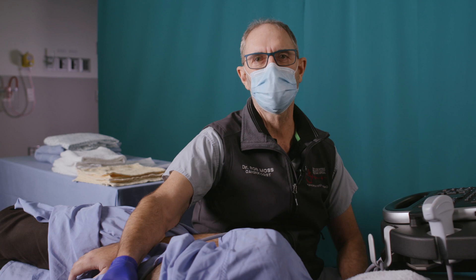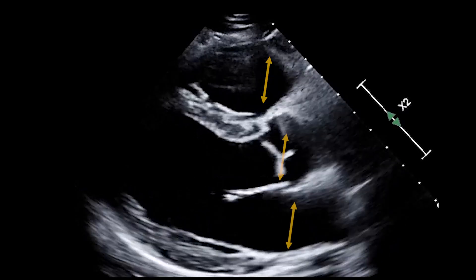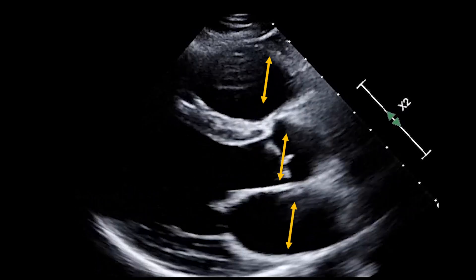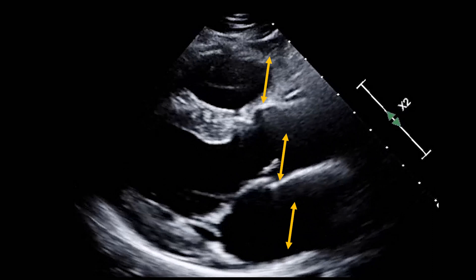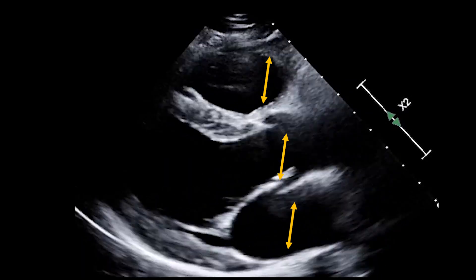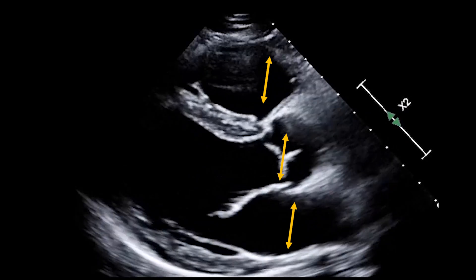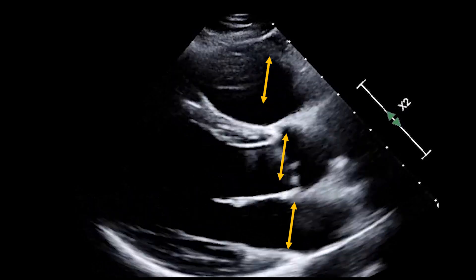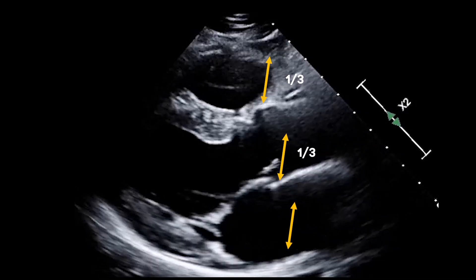The rule of thirds helps us to understand the relative sizes of some of the key cardiac structures. The right ventricle — which is mostly right ventricular outflow tract in the parasternal long axis view — the aortic root, and the left atrium should be equal in size: one third, one third, and one third.